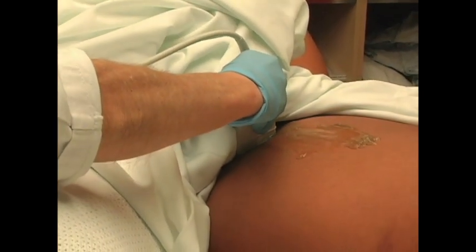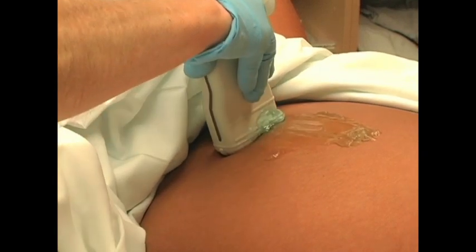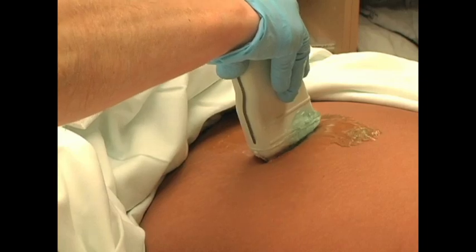Many emergency departments in the United States do not have access to timely ultrasound. Therefore, the use of physician-performed ultrasound can provide significant benefits such as rapid information, decreased length of stay, increased patient safety, and increased patient throughput. Therefore, the use of emergency ultrasound is of significant benefit to both the patient and the physician.